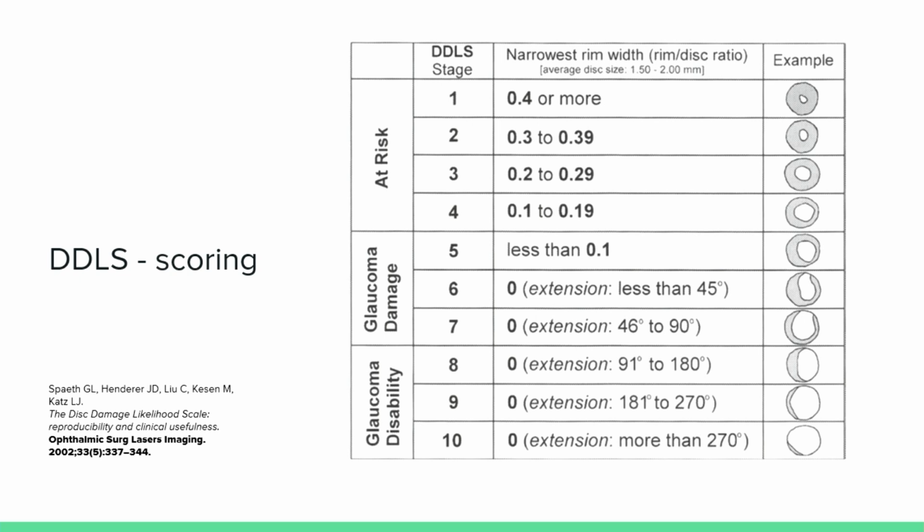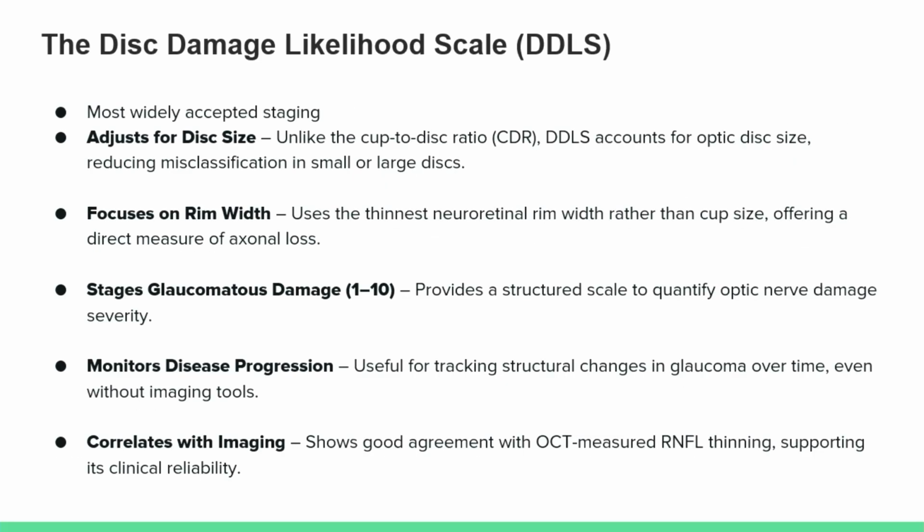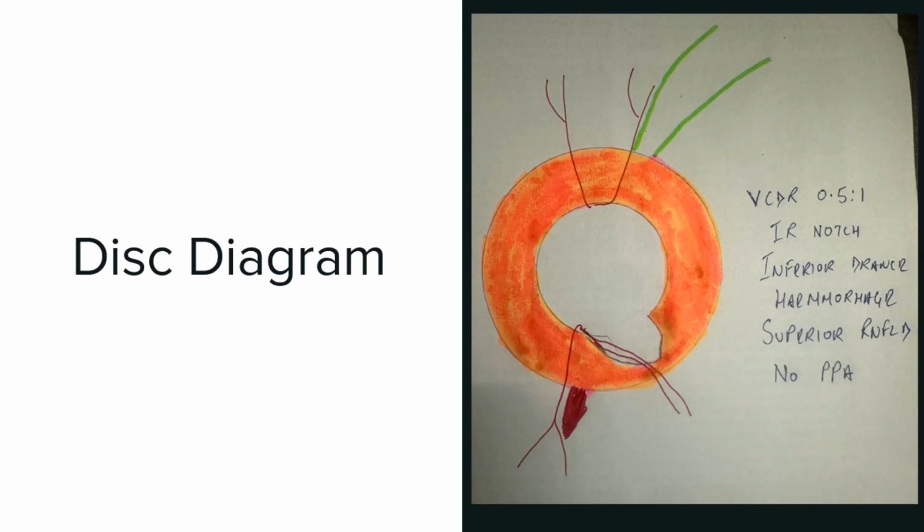Who developed the DDLS staging? Fellows? It is written there. What is the advantage of the DDLS? It is a standardized, reproducible way of grading. It takes into account disc size and gives importance to the rim width to disc ratio.